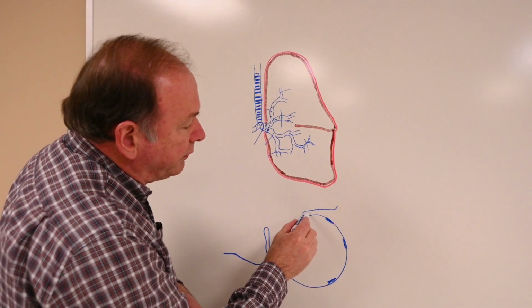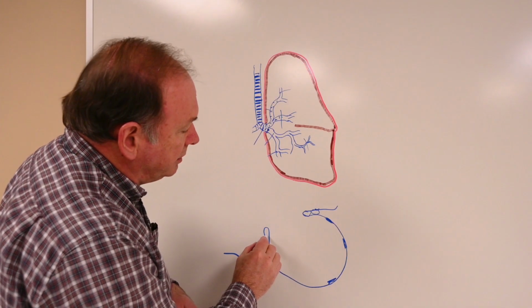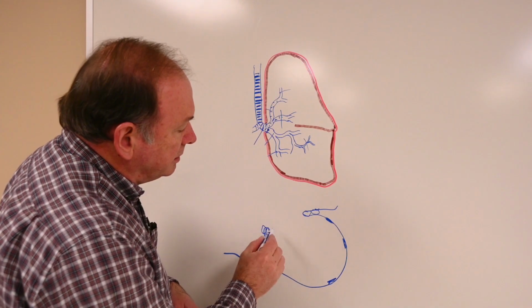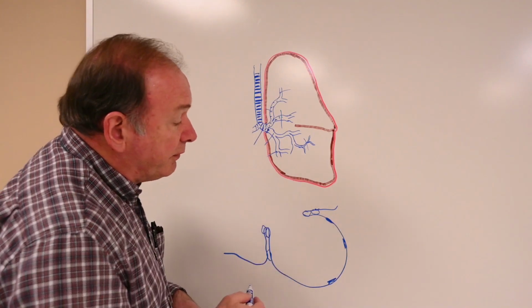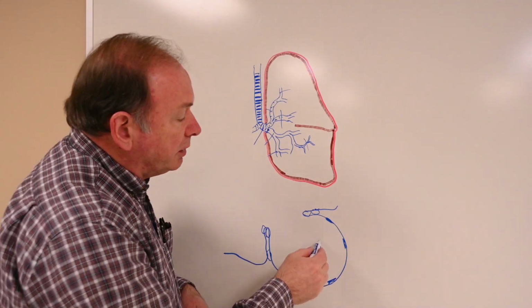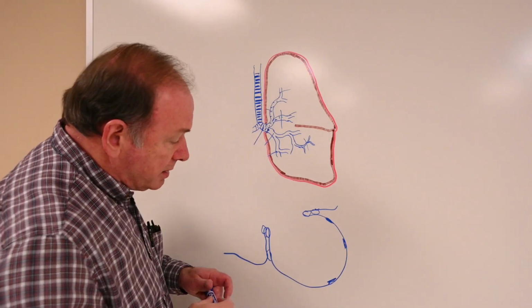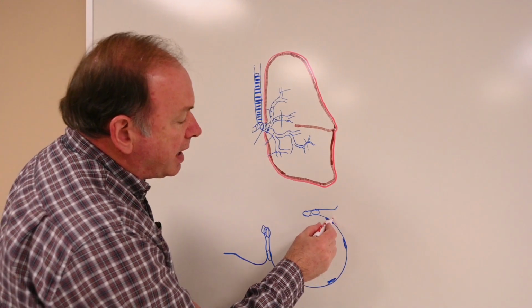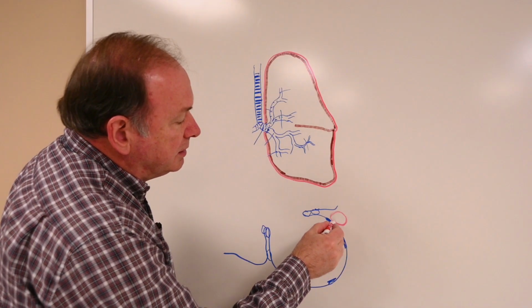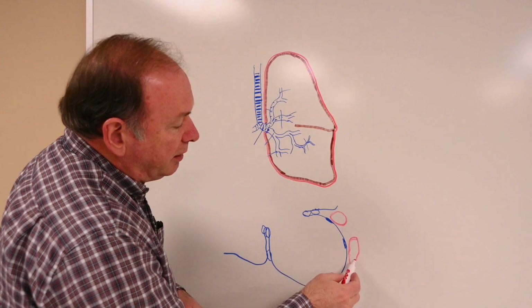And we'll also look for some more cuboidal-like cells that are out here on the margins and other places in there in the septa. These are often referred to as septal cells, so they help form part of the septa between the alveoli out here.